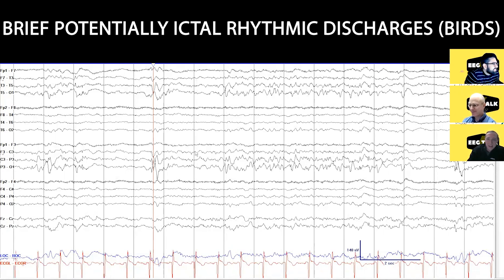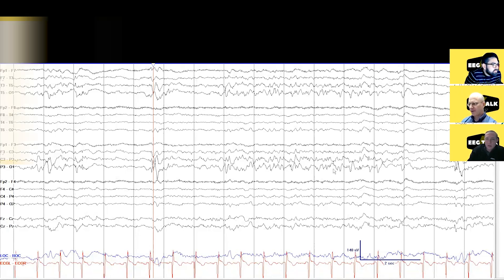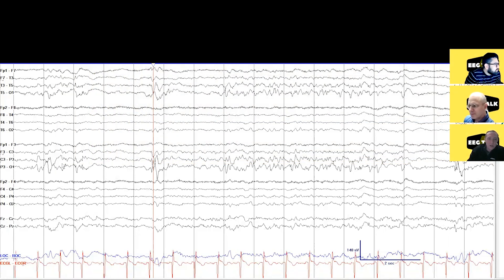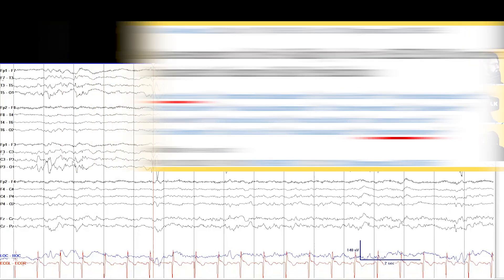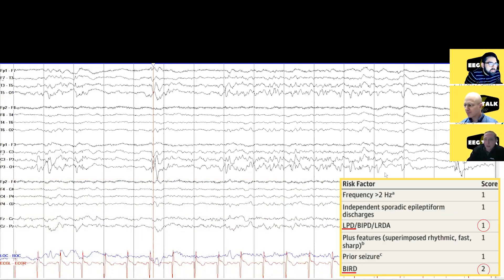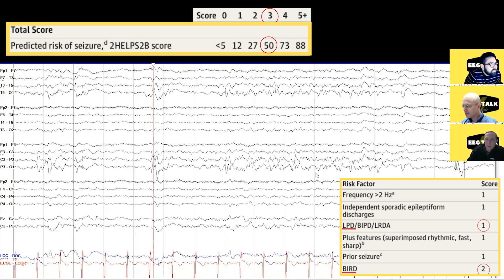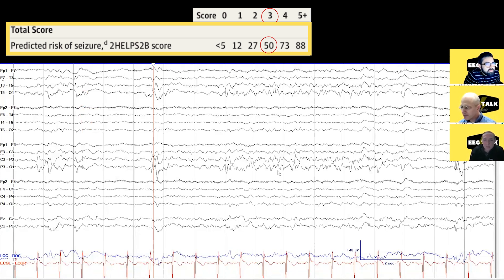So now we have LPDs and we have these BIRDs — and these are even evolving ones in the theta range, which is typically associated with acute brain injury. That's according to Dr. Yu, who has really described much of this. According to the 2HELPS2B score, which we've developed to figure out who's at risk of having seizures, they get one point for the LPDs. And because this BIRD pattern is so close to a seizure — if this went on for another four seconds you would call it an electrographic seizure — you get two points for this. This patient already has three points. They're very likely to go on to have a seizure and need to remain on continuous EEG. You might even consider empiric treatment at this stage.